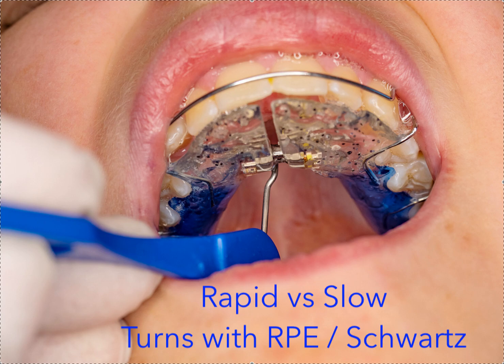The demographics that I was working with, often English wasn't the first language, and even though we get things translated, understanding maybe wasn't happening fully, as well as sometimes weird things would happen, like a parent would punish the kid by overturning. So it made me really, really nervous. So I started doing slower expansion.